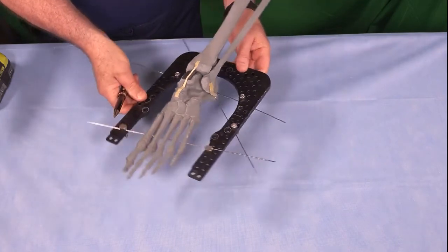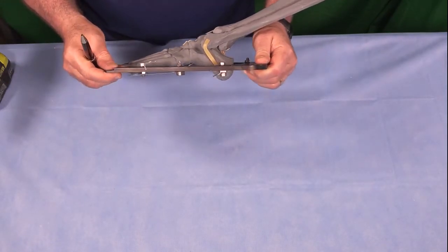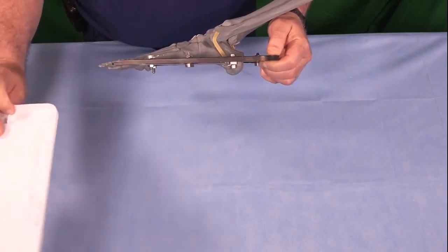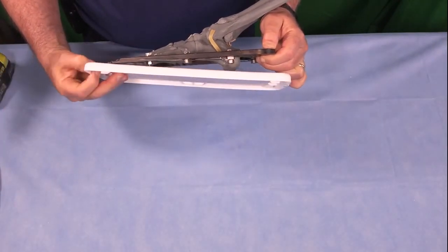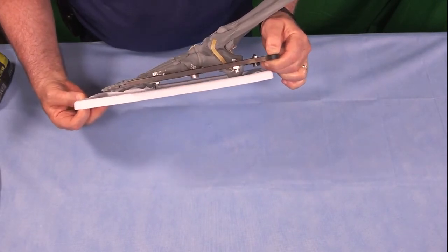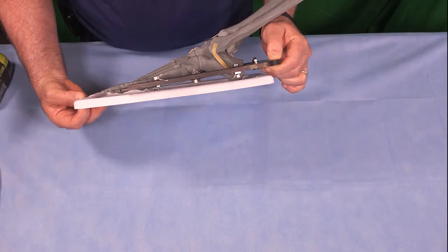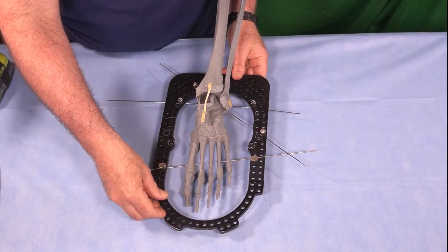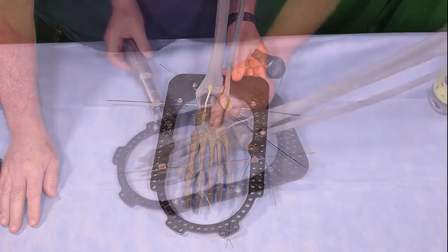And I slid my ring in between the wires, threading or weaving in between so that the ring is now parallel to the plantar surface of the foot. In surgery, we sometimes have a surface, we call it a cutting board, that goes on the plantar surface of the foot. And the goal of that is to have that cutting board sitting on the plantar surface of the foot parallel to the ring. The next thing I'm going to do is attach the half ring. That will close the loop, make this a much more stable construct, and then I'll tension the wires.